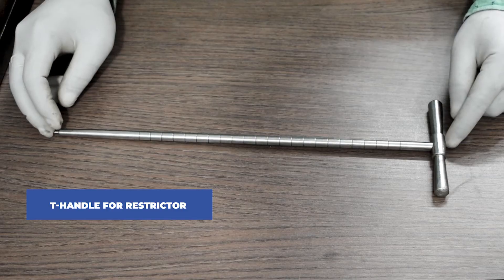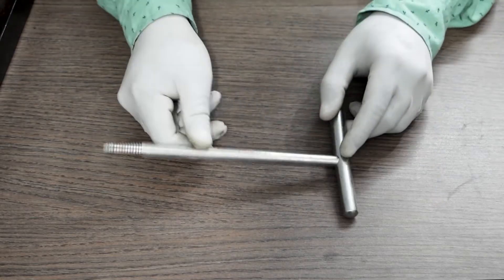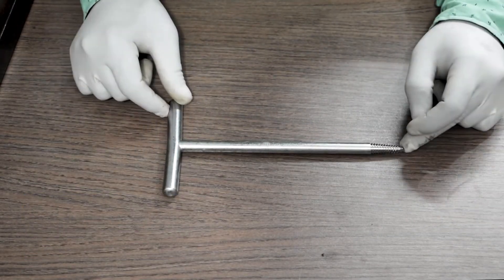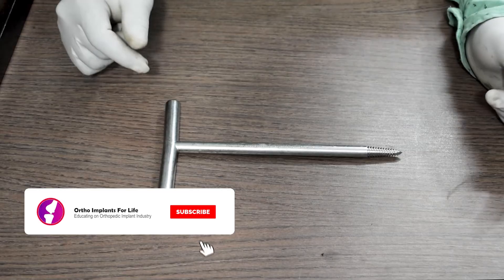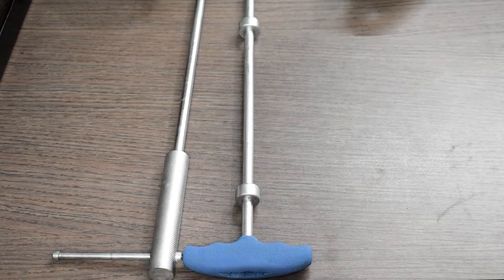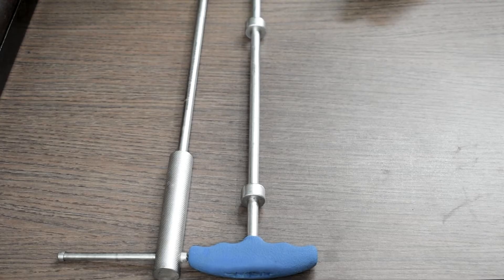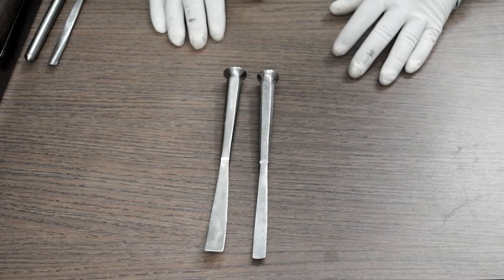This is the T-handle for restrictor. These are the impactor and T-handle extractor. This is the T-handle effector.